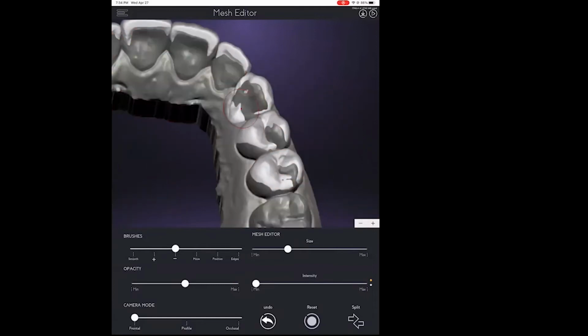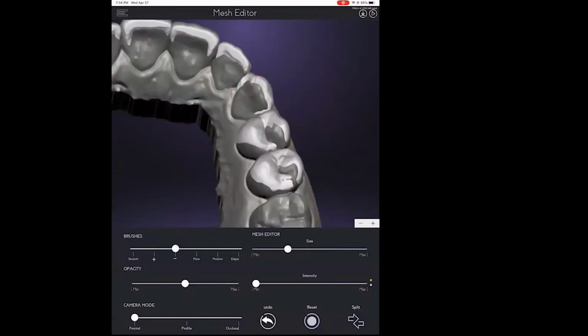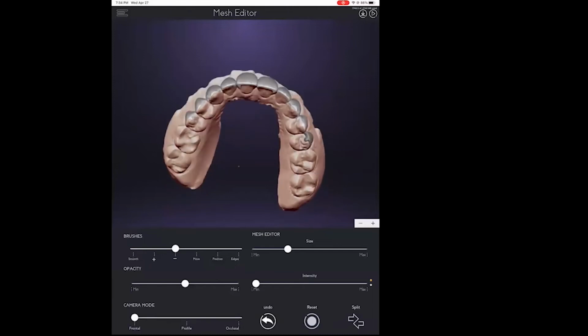Then on the following week, the patients can come in and all of them can perform these smile trials. I can guarantee you that this type of workflow allows you to win more patients. It gives the patient the sense of being in the right place, of being heard, of knowing what's happening with their smile prior to initiating the treatment.